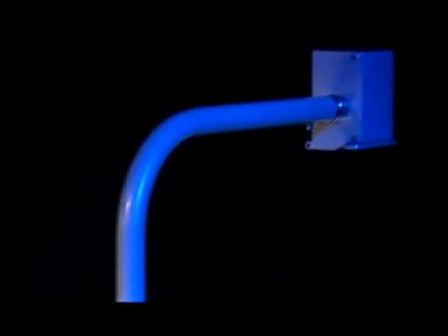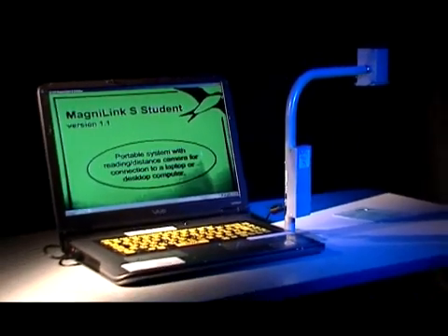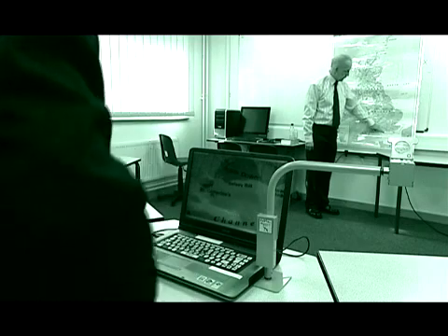The Magnilink S Series MLS Student is a portable CCTV system that can connect both to laptops and desktops. It is compact, light, quickly assembled and controlled by the computer. Visually impaired students are benefiting greatly from this powerful magnification technology.